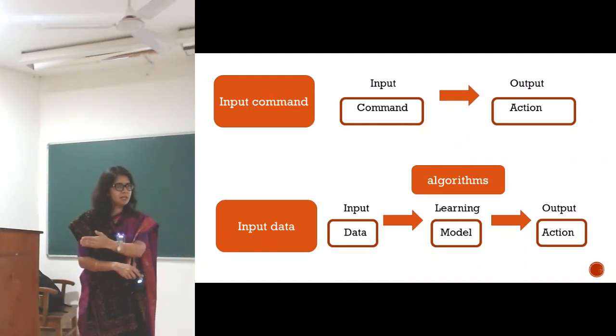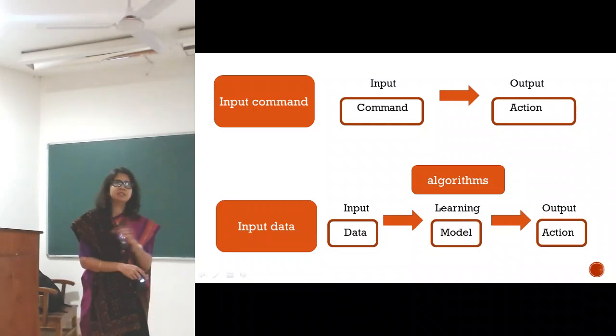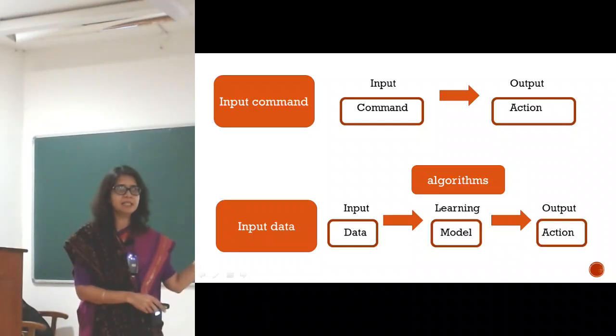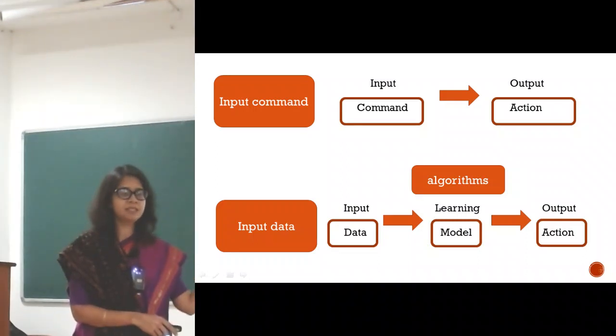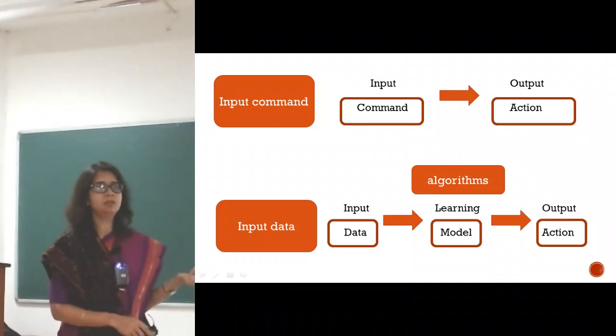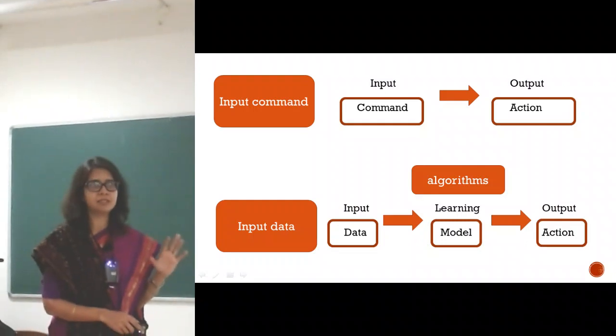If I give him 10 invasive ductal carcinomas grade 3, all 10 of them can be treated similarly by him because he has no other information from pathology, but they will not behave similarly, which is what he was trying to say with precision medicine. But with big data and deep learning, we are now thinking that the computer can tell us, even in those 10 cases, that there is a difference, and this case will behave worse than that case. That is knowledge beyond what is currently available to us in pathology.